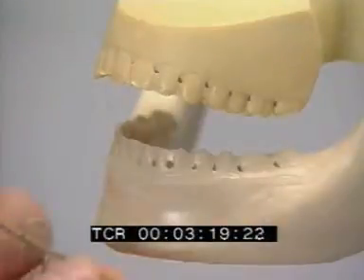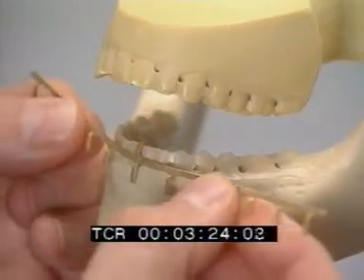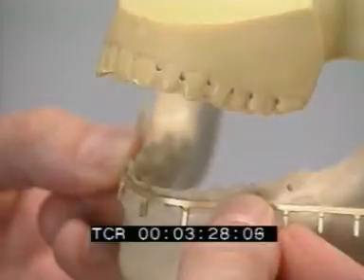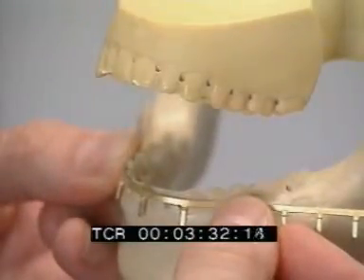The prefabricated arch bar must be adjusted in shape and length to the individual situation. The arch bar should not damage the gingiva. First, the bar is closely adapted to the dental arch. The position of the bar should be between the dental equator and the gingiva.